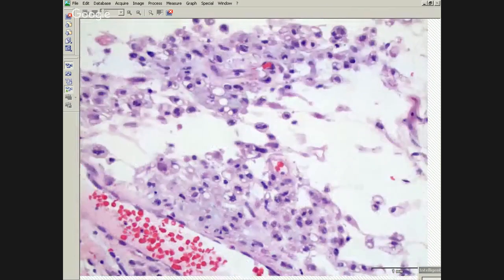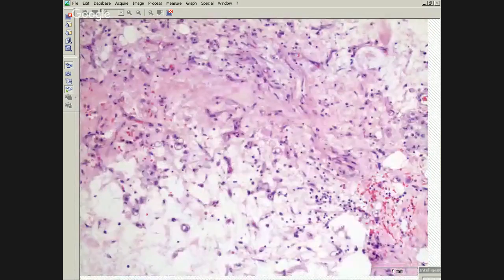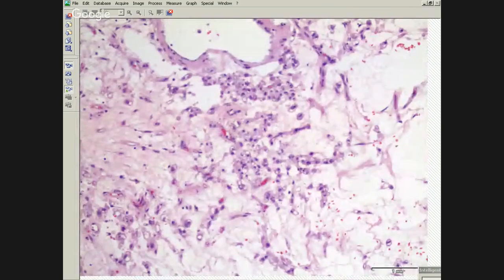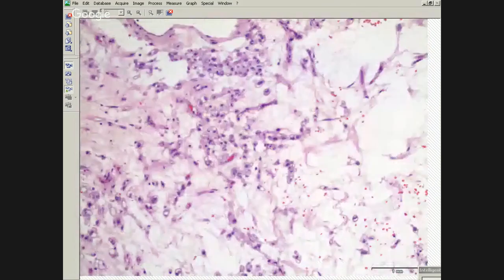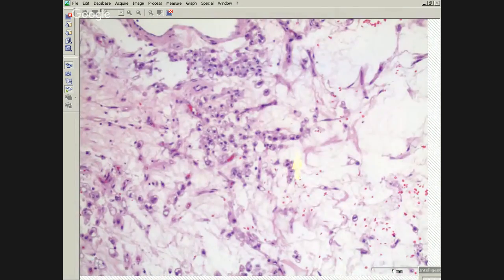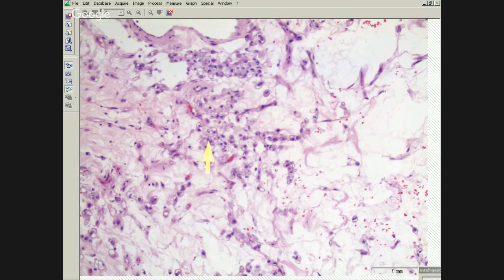Now, these, as you might imagine, are extremely rare as a primary pleural tumor. But the point of showing you this is it does have overlapping features with epithelioid hemangioendothelioma. If you just had a smaller biopsy and only had this, that might be a consideration. Similarly, you can sometimes have clear cell or signet ring cell change in a mesothelioma.